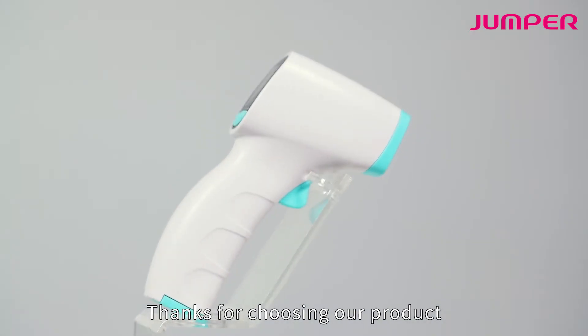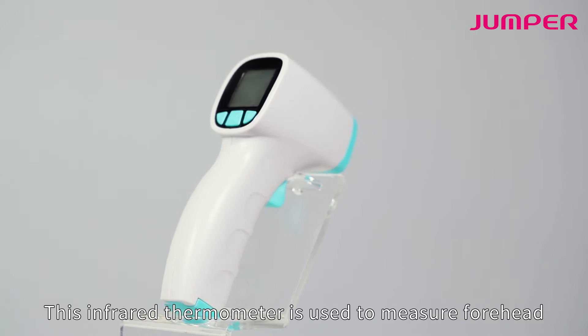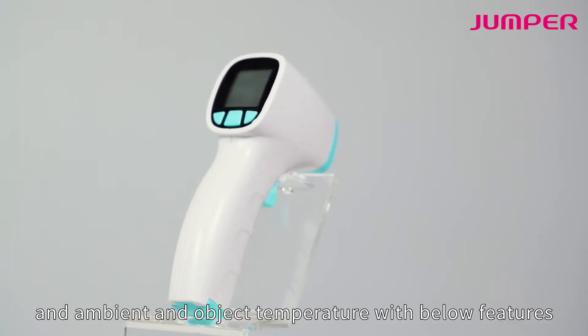Thanks for choosing our product. This infrared thermometer is used to measure forehead, ambient, and object temperature.